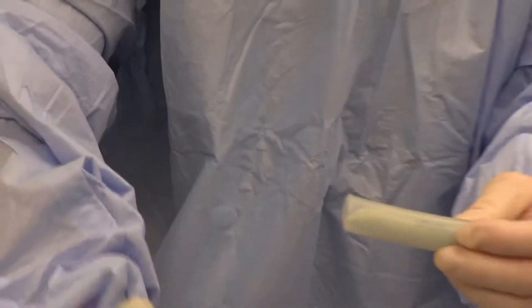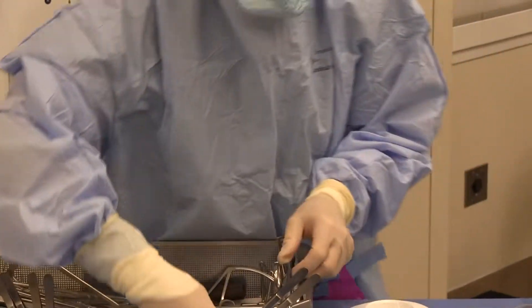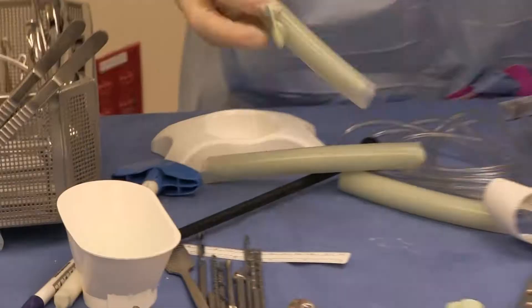What I like to do — because this is a round tube — I'll take one of the trays in the OR and I will just smush it flat. So that's one.